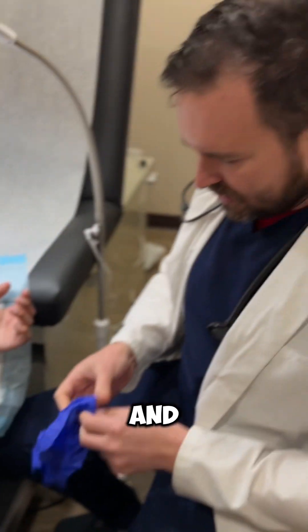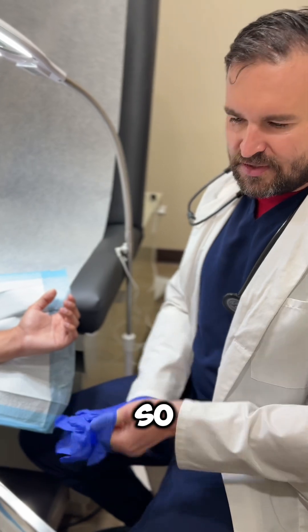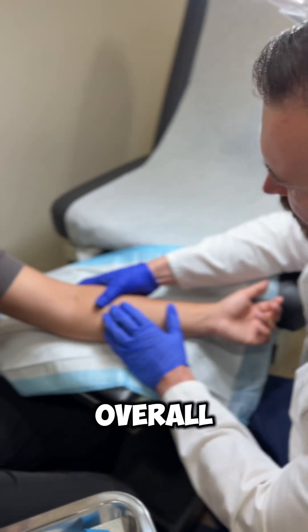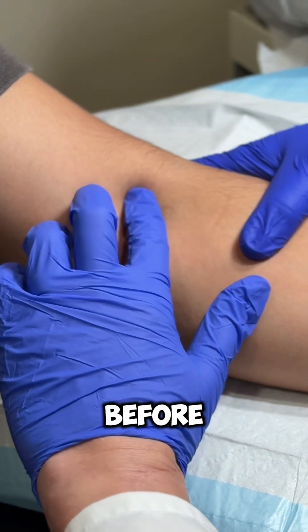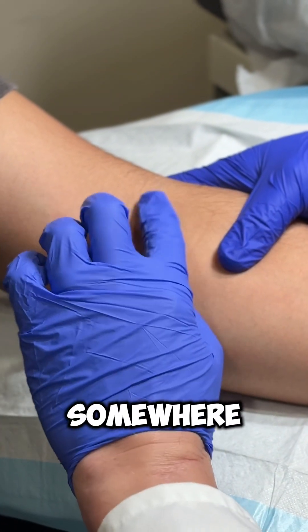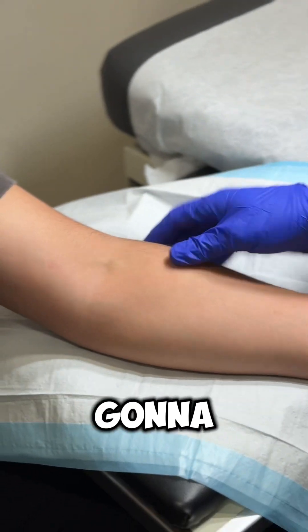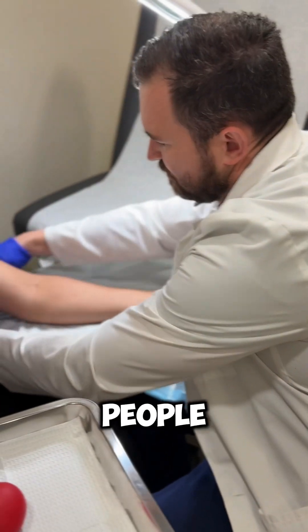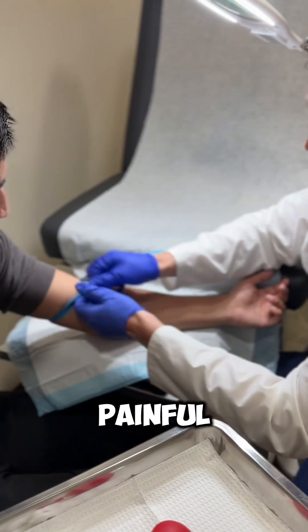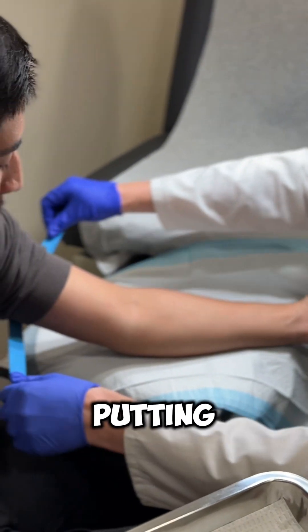I'm looking overall and it looks like you probably had blood drawn before. I'm feeling it before I even put any tourniquet on. I know it's somewhere here — I'm not 100% sure — but before I put the tourniquet on I want to try to assess it. A lot of times people just do this, which is very painful and very uncomfortable.